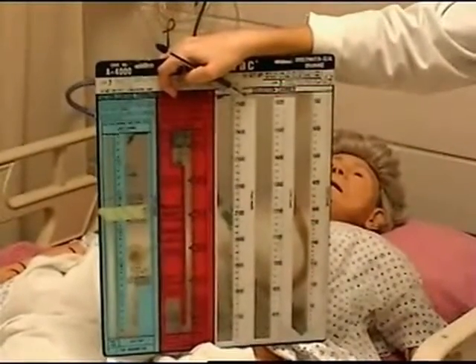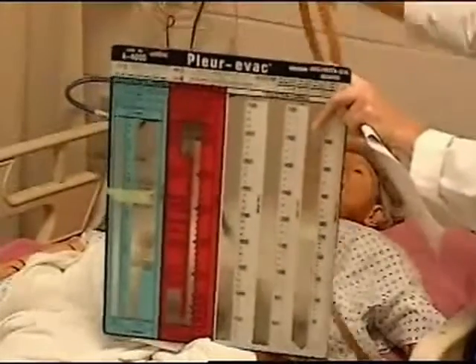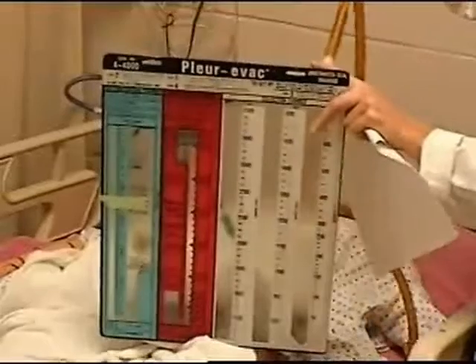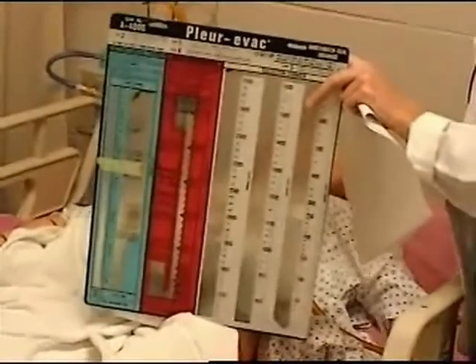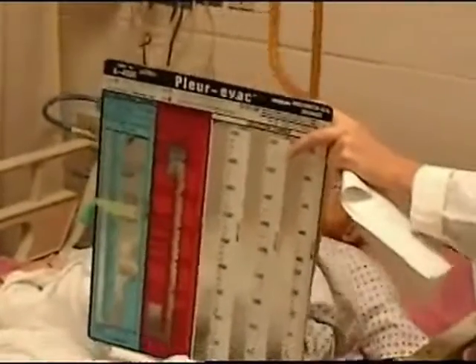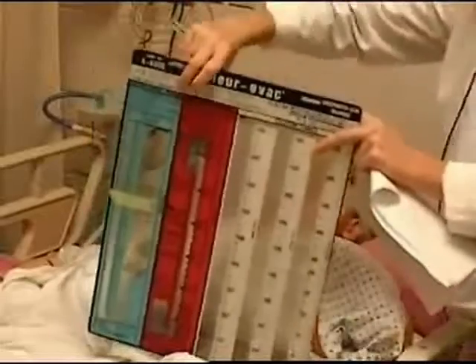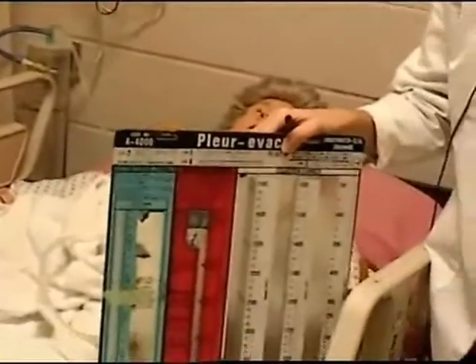If the drainage stops suddenly, follow your tubes and make sure that your tubes are not kinked or bent over, the patient's not laying on them. This one is hooked to the suction. And the longer one will be hooked to your patient, and it's longer because it gives them some more room for the patient to move and roll over and things of that nature.